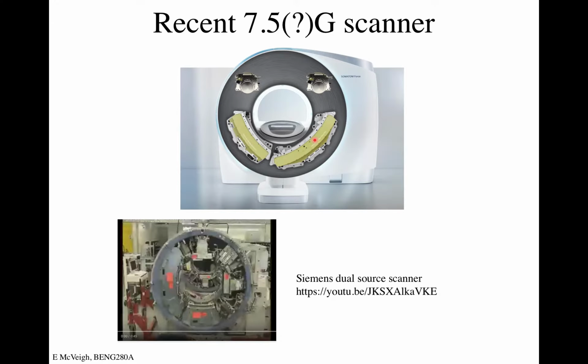So another take on this is what Siemens did. They said, okay, we'll make a detector that's, say, 128, or maybe even 64 in Z, but we have a regular CT scanner, so I have an X-ray source here and my detector here, and you look at it and go, oh, there's some space left over. I'll put another X-ray source here and another detector here.